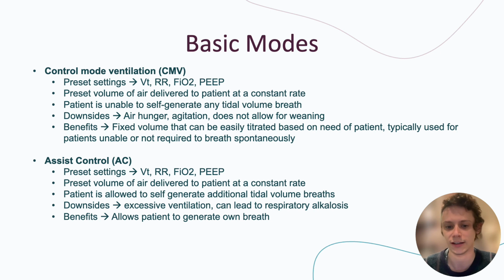However, some of the benefits is it is a fixed volume that can be easily titrated based on the patient's need. So if the patient is fully sedated, it's actually very useful in terms of finding that perfect volume and titrating it to help that patient recruit back the lung alveoli and get their strength back. It is typically used for patients who are unable or not required to breathe spontaneously.